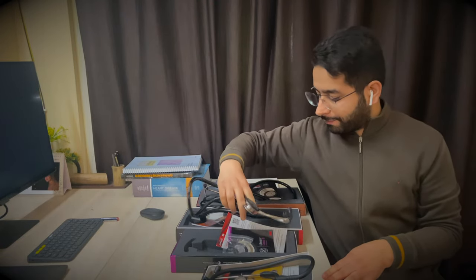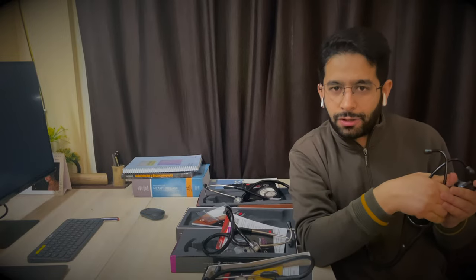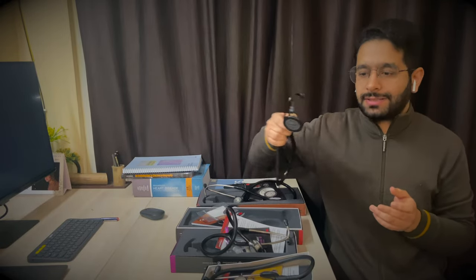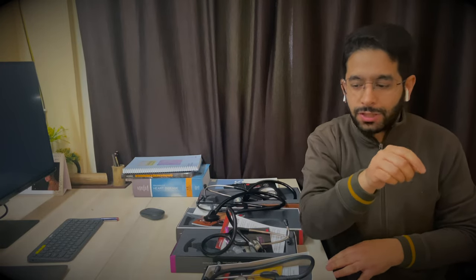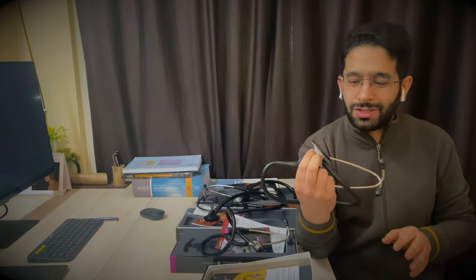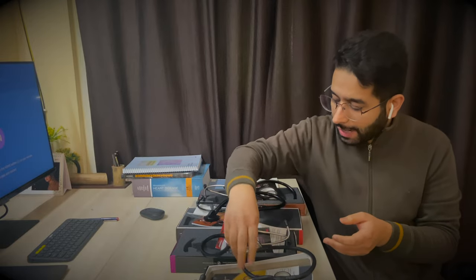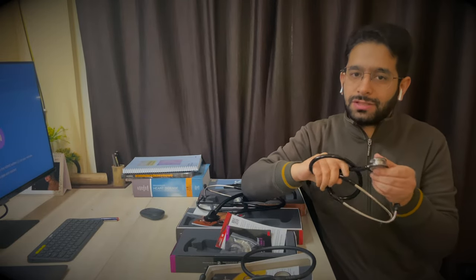This Littmann Classic costs around seven to eight thousand rupees and comes in all different colors. The cardiology stethoscopes — costing around 16,000–18,000 rupees — are recommended for cardiologists, ICU physicians, or physicians wanting a detailed cardiological examination. As for the lightweight stethoscope, I don't think most people should buy it — it's meant for nurses for recording blood pressure or basic auscultation. Beyond your first year of MBBS, go for the Littmann Classic.